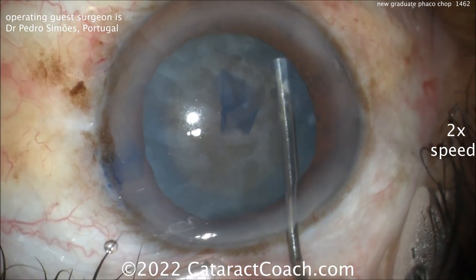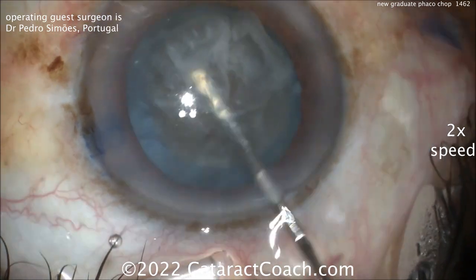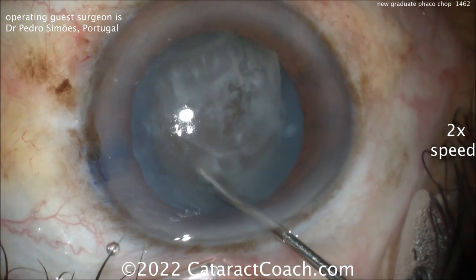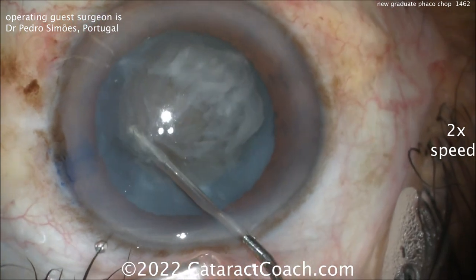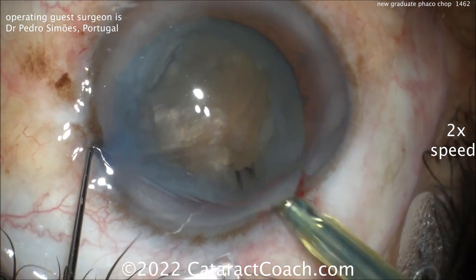A little hydrodissection here. Hard to see the fluid wave because this lens is quite opaque, but a lot of that liquefied cortex — look at that already coming out. The lens does rotate very nicely, so this is going to be a pretty dense cataract.